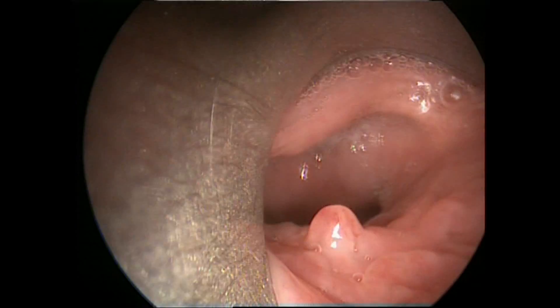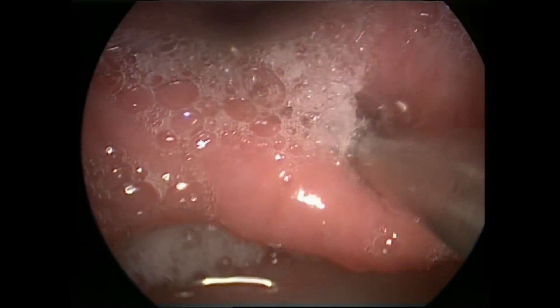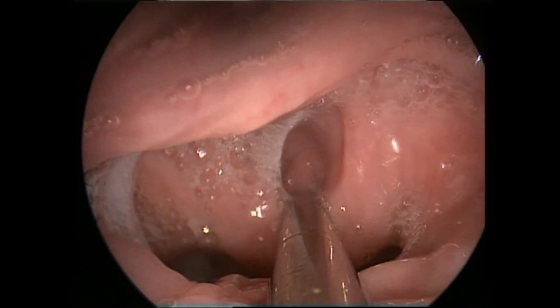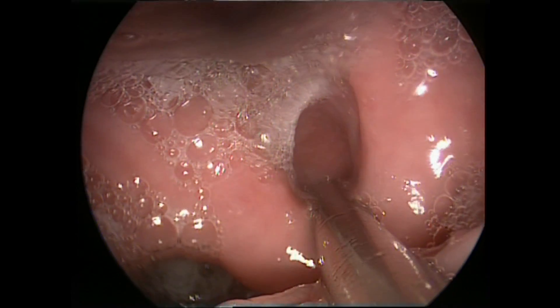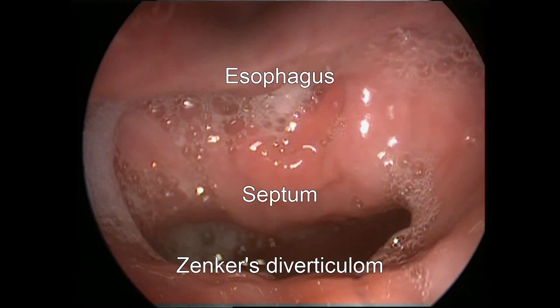In this view, our scope is positioned just posterior to the larynx. Therefore, we are viewing the inferior parts of the hypopharynx, or actually the beginning of the esophagus. The tip of the suction is actually inserted inside the lumen of the esophagus.